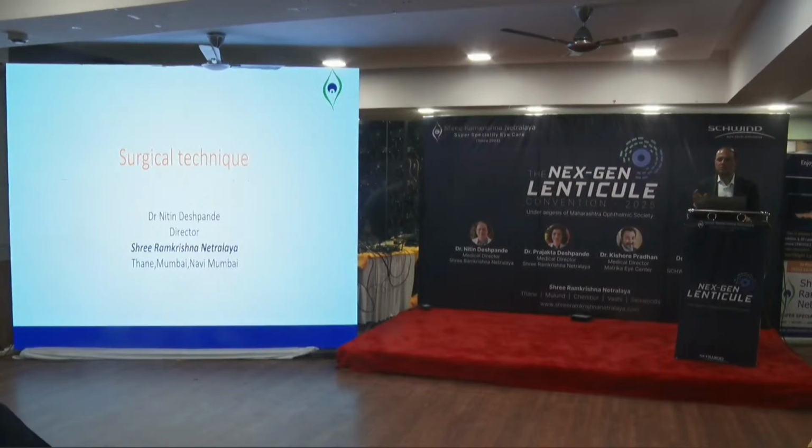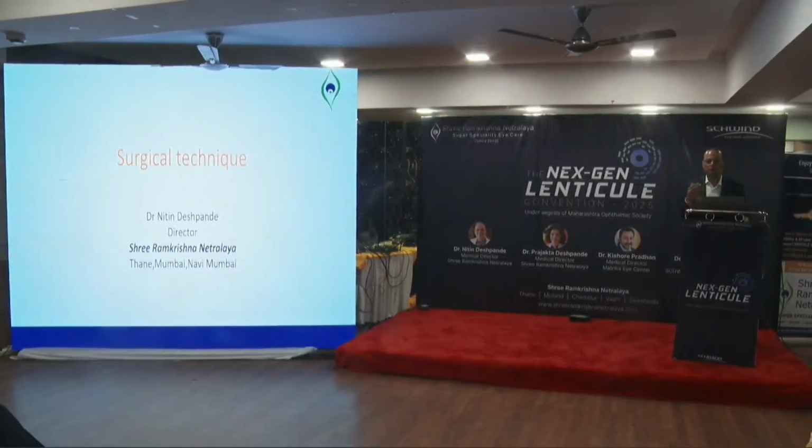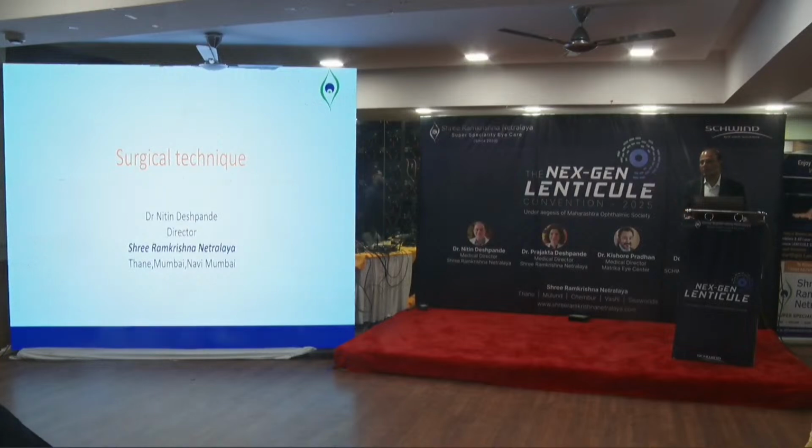So after you learn the surgical technique, the next very important thing is your energy settings, which Dr. Prajakta already highlighted. And the very good feature about this machine is dose, because if you manage to give the least dose to the cornea, your patients are going to recover very fast. So that is very important. So I'll just take you through the surgical technique, and first I'll show you my case.